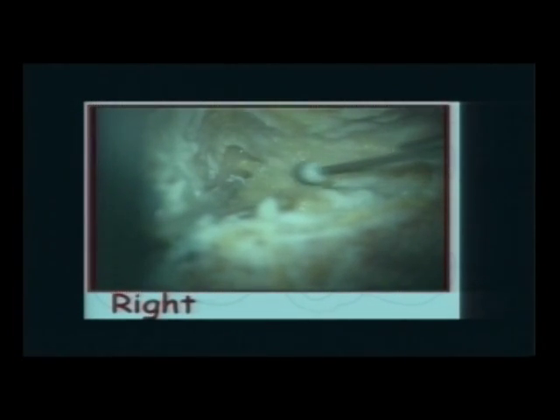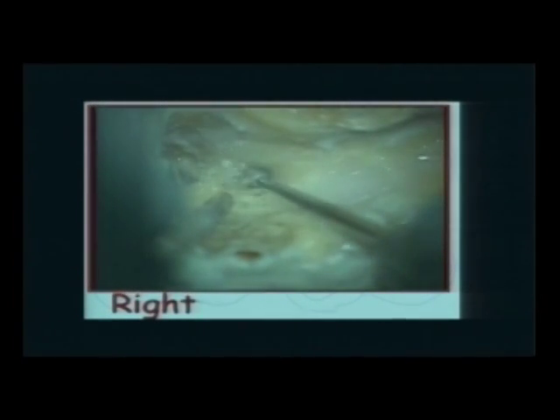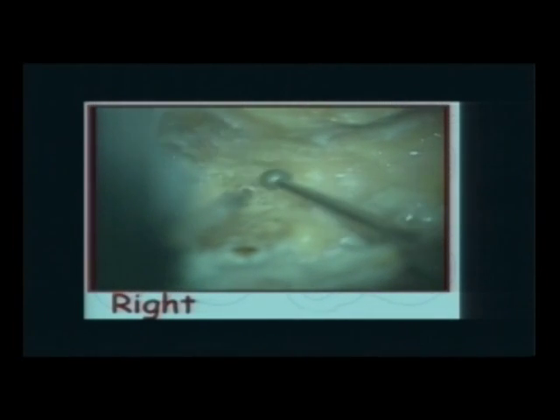Now, this is the short process of the incus and the lateral canal, and I'm drilling along the posterior tympanotomy. You see how the suction is close to the drill, and the water is coming down, and your suction is close to the drill and a little bit higher, so that you can see through the clear water, but at the same time, you don't have to stop drilling.